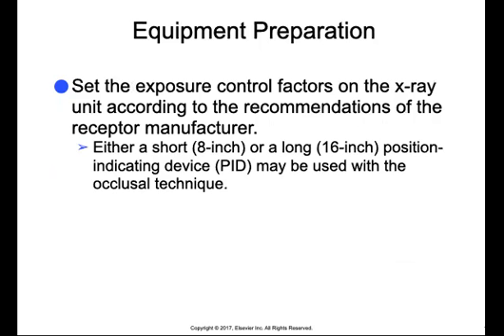After patient preparation, equipment must be prepared before the exposure of any receptor begins. This will include setting the exposure control factors such as the kVp, the mA, and the exposure time. Also, you'll use either a short 8-inch or a long 16-inch PID with the occlusal technique.